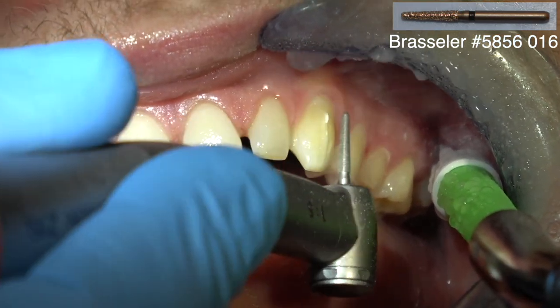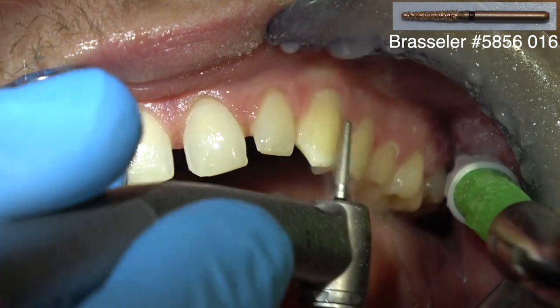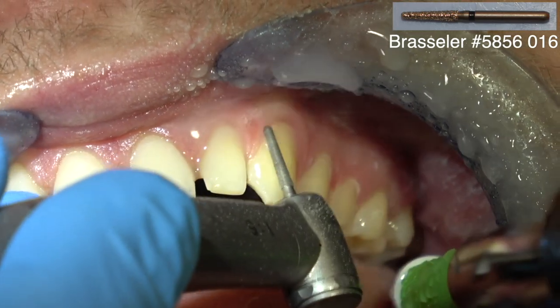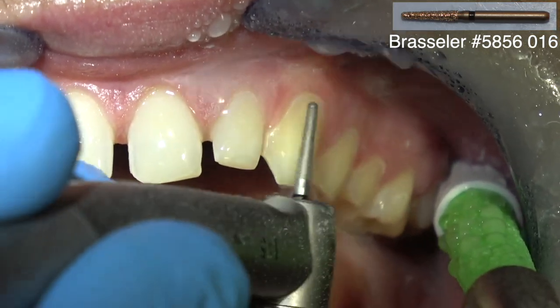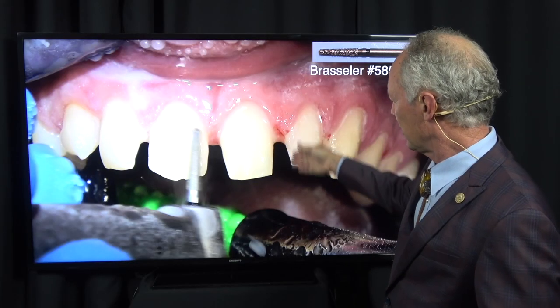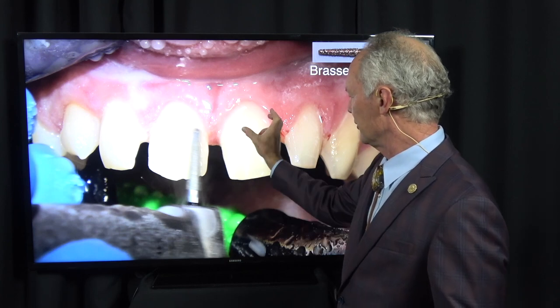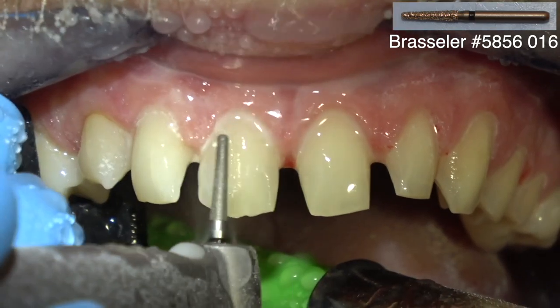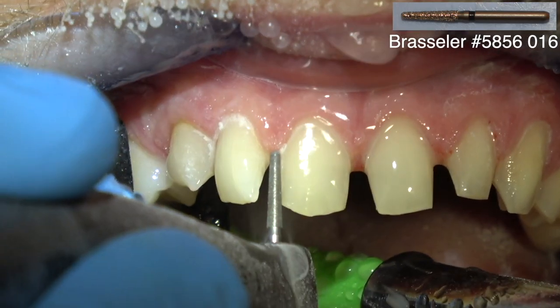These teeth are just sort of a normal yellow shade, about a B or A3. The facial reduction is only about a half a millimeter. If they were darker, you might have to reduce the facial a millimeter just to give the technician a greater thickness for the veneer to block out the dark. Now, what do you do in cases like this where diastemas are already present? I don't need any more space, but I need the interproximal surfaces to be in such an alignment that the veneers will draw. So if they've got a bulge, as most teeth do, you've got to remove that and prep these teeth kind of like an upside down Dixie cup so the veneer will draw onto the tooth.